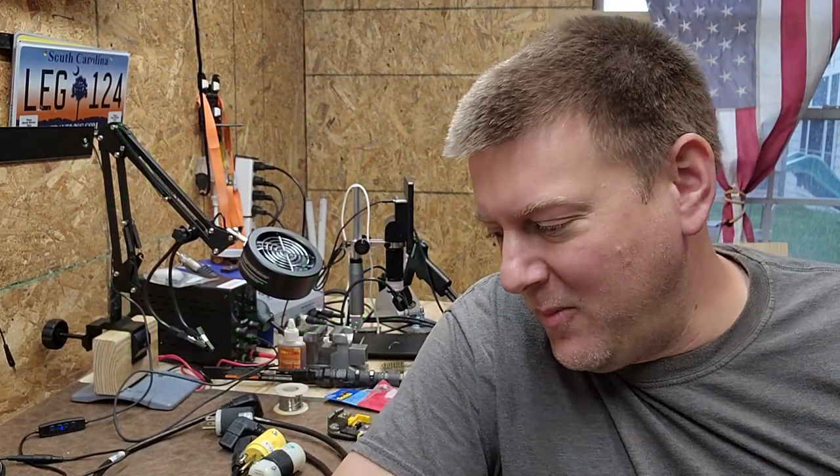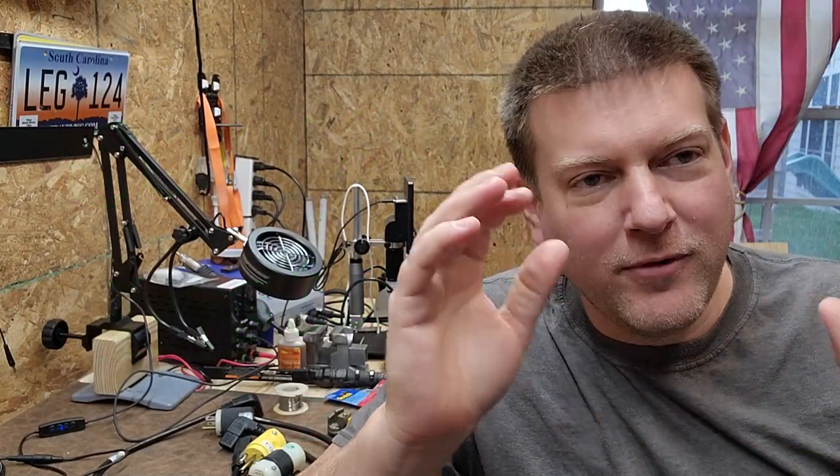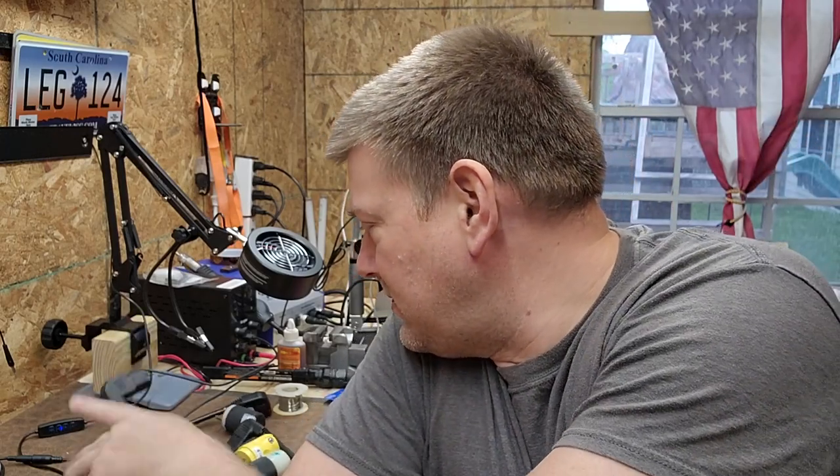Hey everyone, welcome back to Better Biomed. Today I'm going to go over a very basic technique for applying plugins on cables. It's absolutely essential, and I know I've covered this material before, but I've had several people write me recently saying they did not know the correct way to do a plug-in. So we're going to go ahead and take this moment — I'm going to show you how to do a NEMA 15-amp plug from scratch, top to bottom.